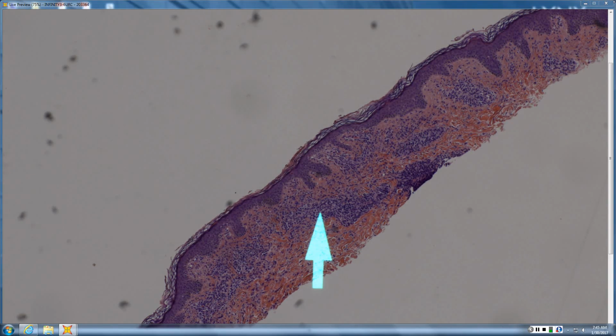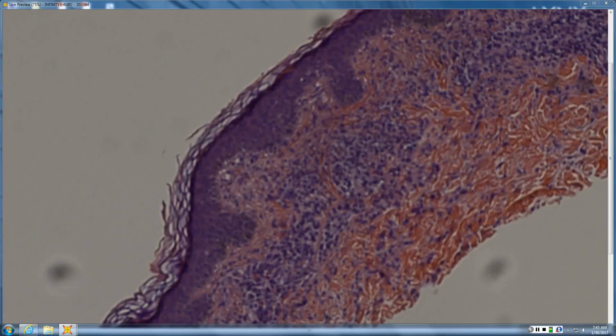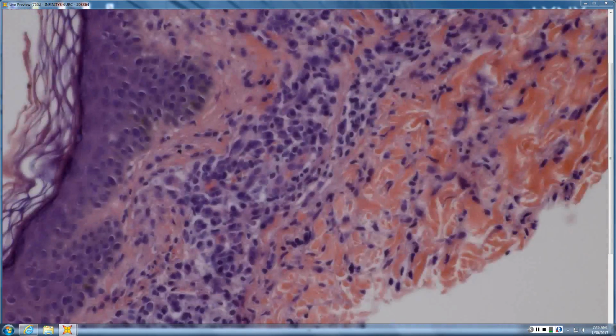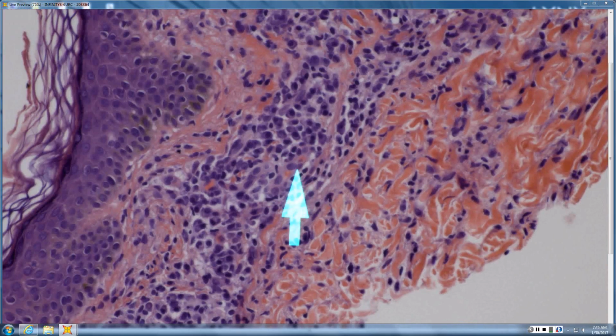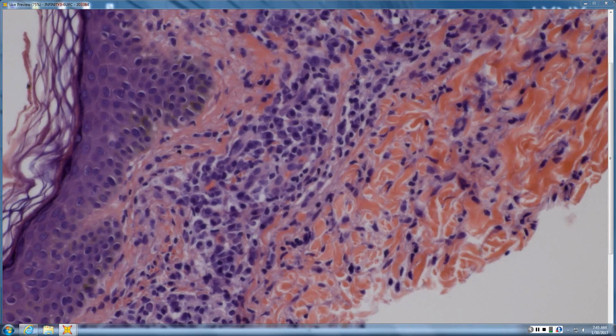And then let's look at the rest of what's going on. Is the infiltrate just perivascular, or is it interstitial too? No, it's interstitial. Kind of busy, right? Mhm. And then you look at the infiltrating cells. What kind of cells do you have? There are lots of plasma cells. Lots of plasma cells. Anything that you know of that gives you endothelial swelling, lots of plasma cells, and an interstitial busy pattern? Syphilis. Syphilis.